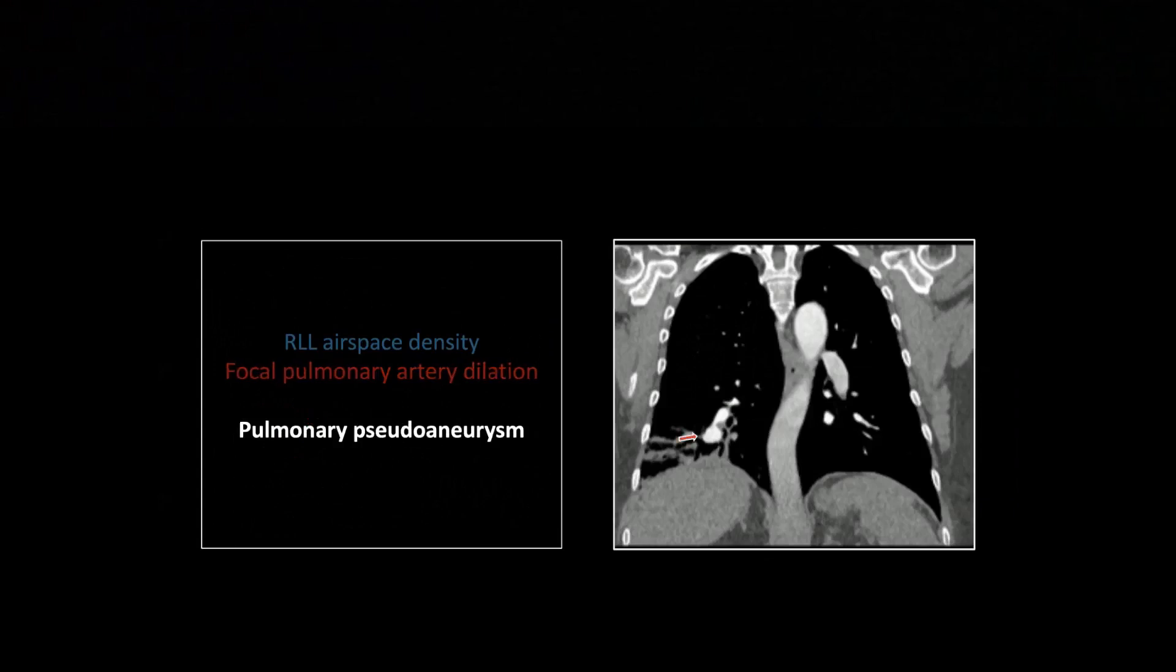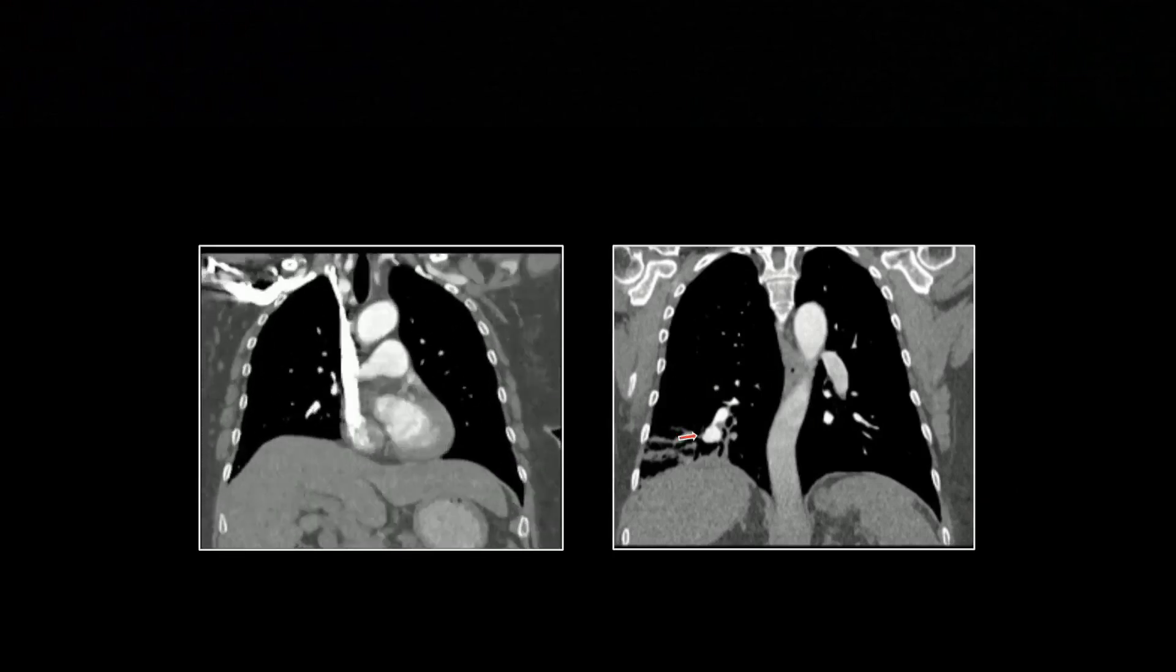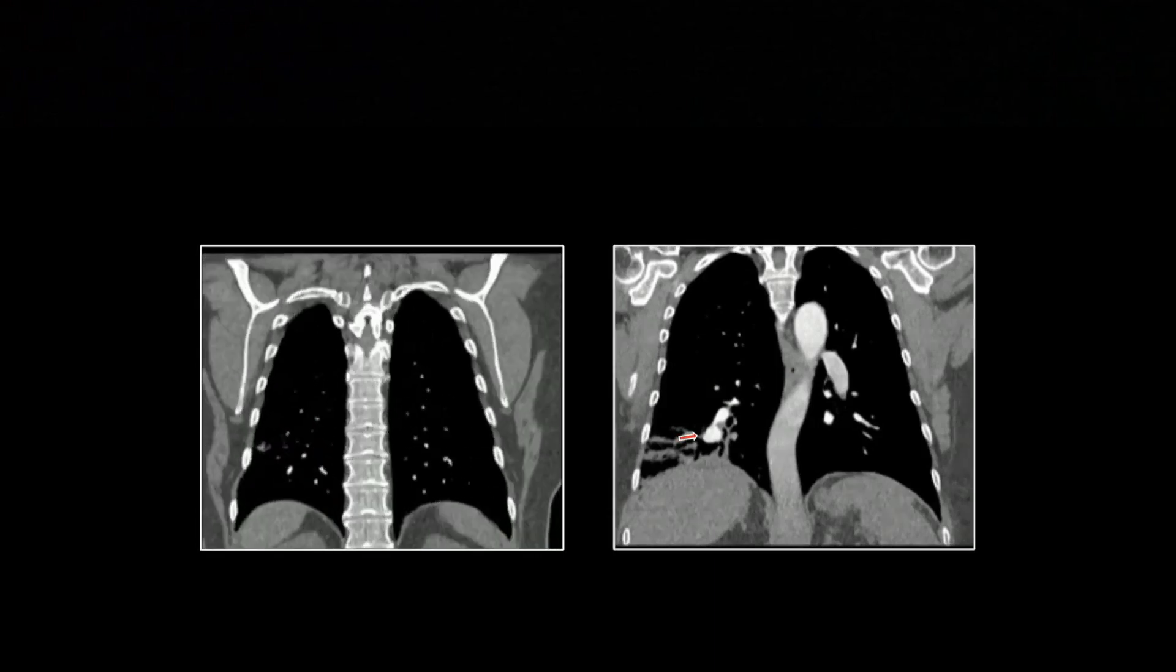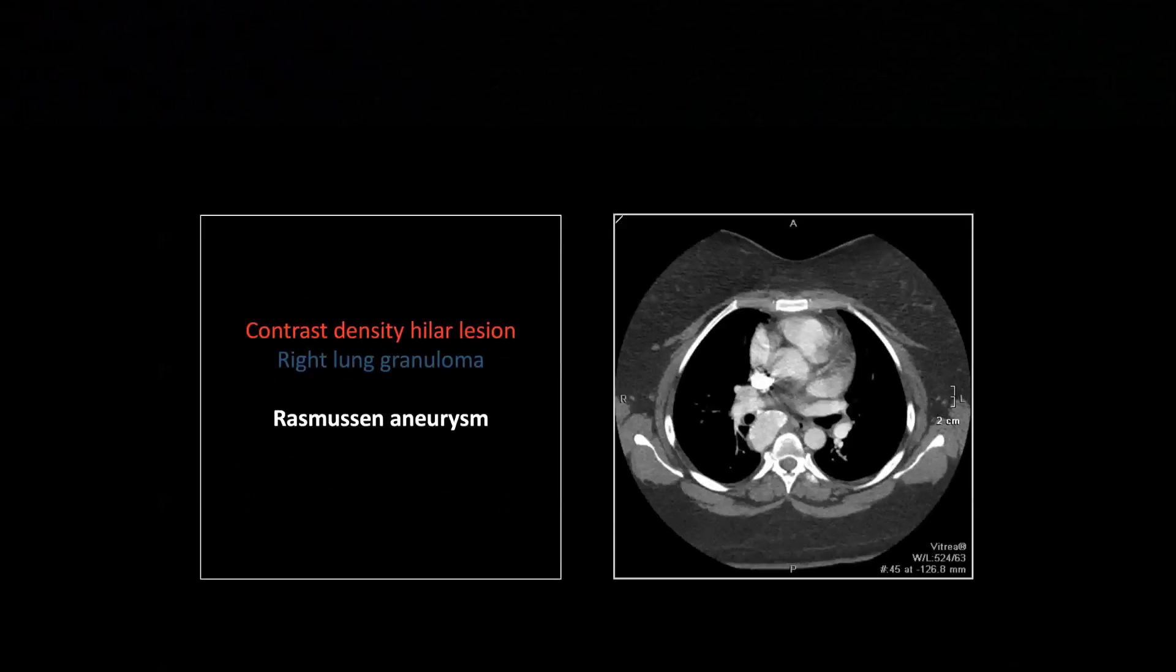This is much better seen on the coronal. You can see there's a little neck extending to the pulmonary arterial branch that's supplying this pseudoaneurysm right there. That is a destructive pneumonia with pseudoaneurysm formation.